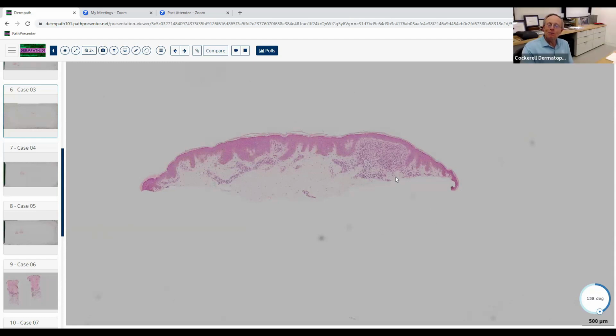Can I possibly convince you maybe the other direction? Switch it around, more histios than lymphs. Yeah, because if you look, these are the lymphocytes, right? Remember we talked about those jet black cells at low magnification. So these are the lymphocytes in here. But notice that these pale cells here that are forming the bulk of this little nodular aggregation are the histiocytes. So when we talk about histiocytes predominating, what is that a sign of? What do we call that when histiocytes predominate in an inflammatory infiltrate? Granulomatous inflammation? Good. It's granulomatous.